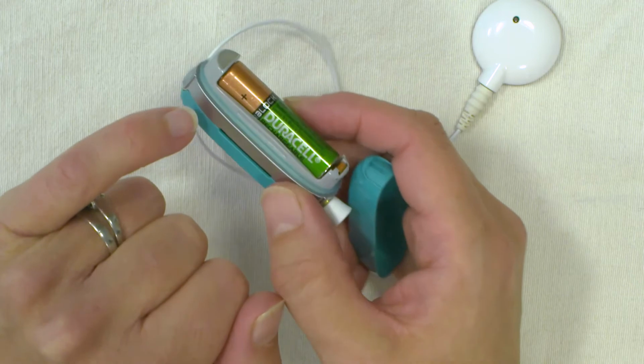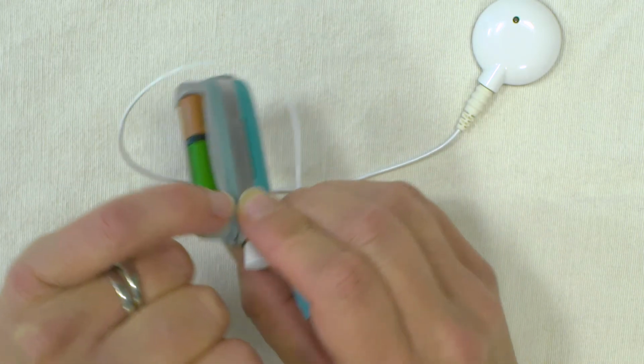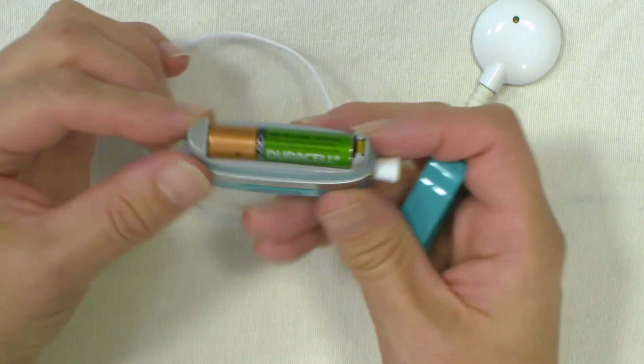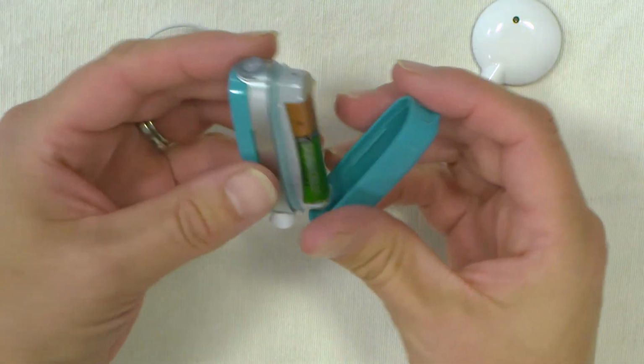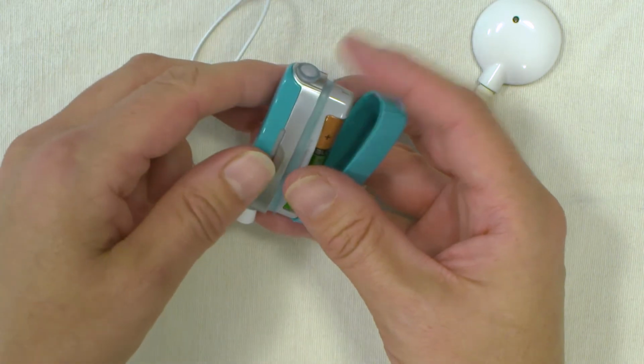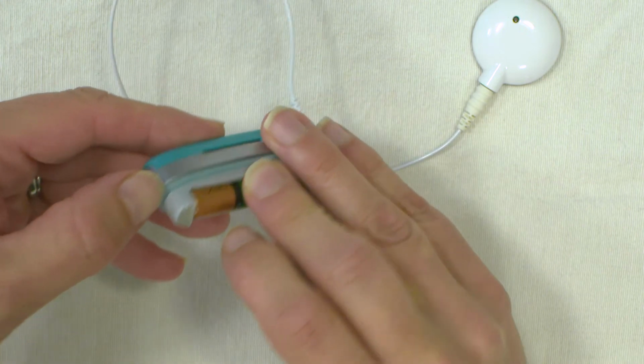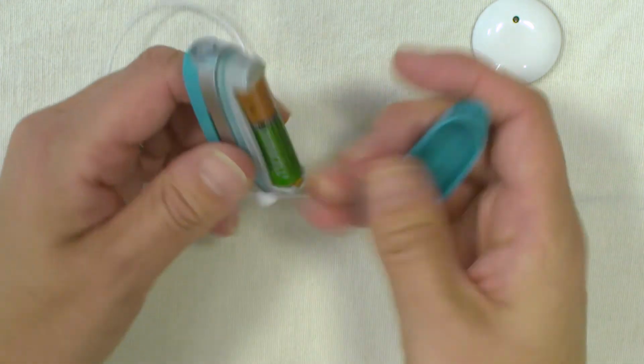waterproof. And also there's a rim here that mustn't be damaged. So if you're trying to get this off, you mustn't lever it off with a tool of any kind, because you could damage the plastic rim seal here that makes it waterproof.